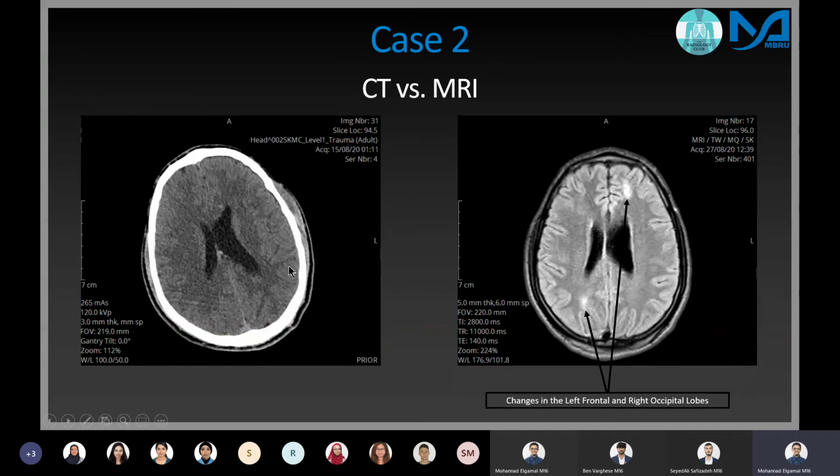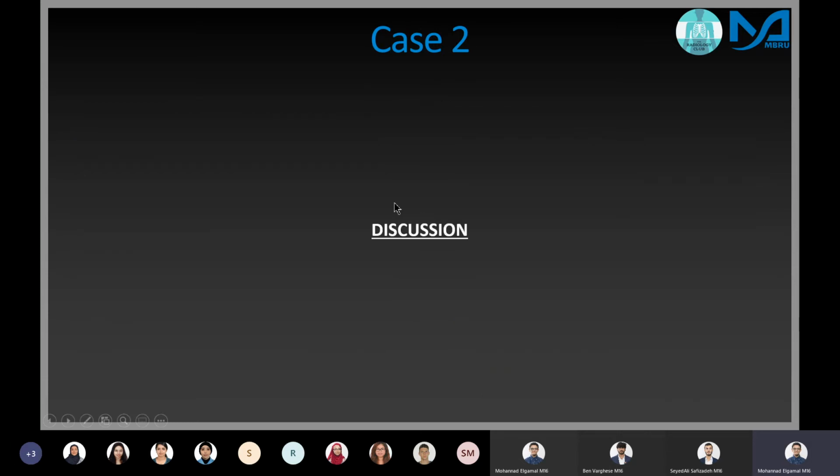But I just wanted to let you know that yes, MRIs are a lot better, especially with tissues like brains, to indicate specific lesions, soft tissue lesions. But the CT, regardless, I know I'm favoring MRIs right now, but CTs are very important in situations like this to pick up any, for example, extradural hematomas or subarachnoid hematomas or hemorrhages, or things like that.